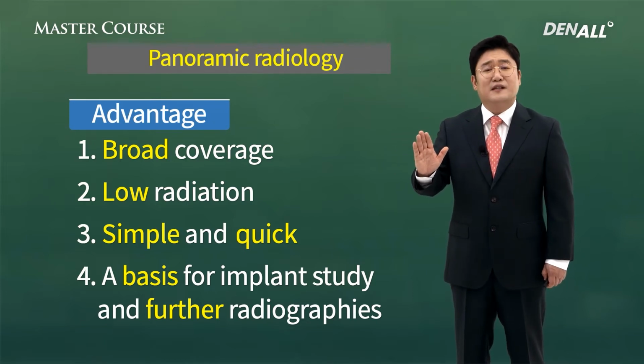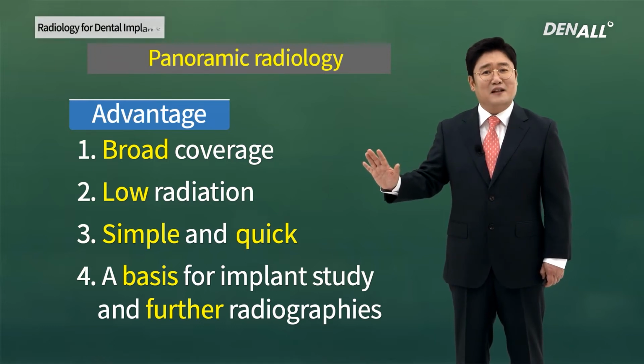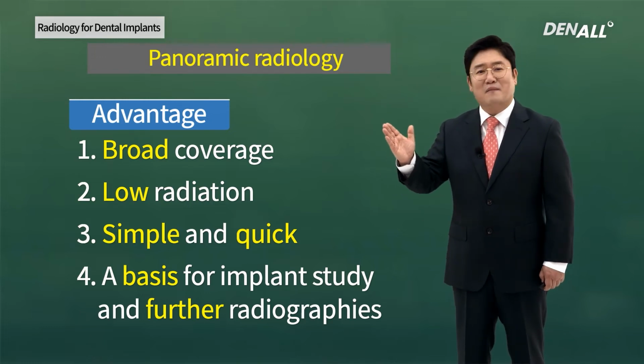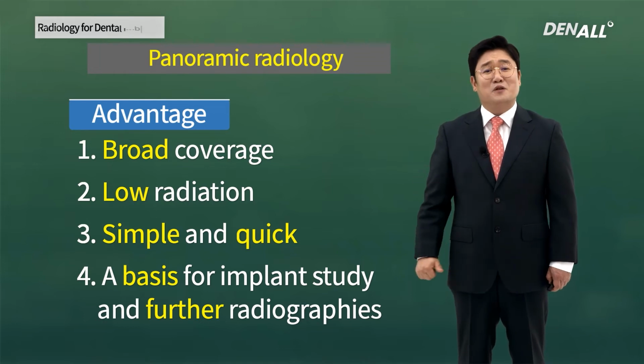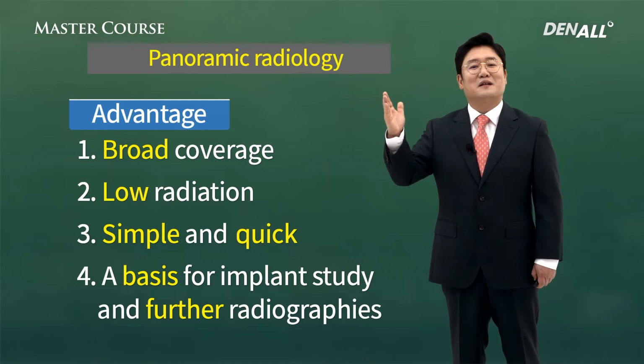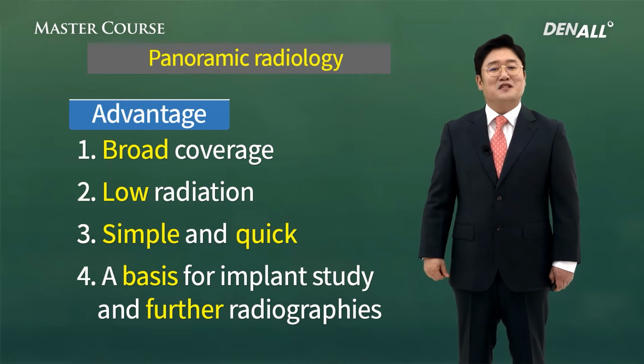Another thing, in Korea, CBCT is very widely actively used, but in other countries, excluding Korea, still panorama is used quite a lot for implant surgery. Therefore, that's the advantage of using panorama.